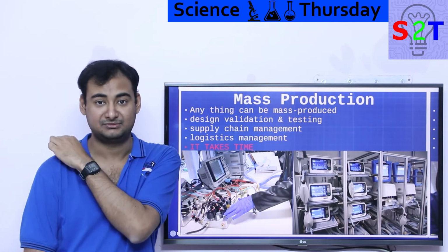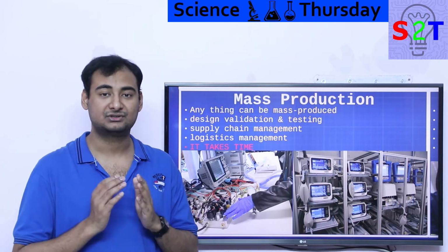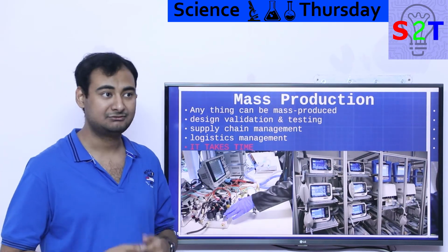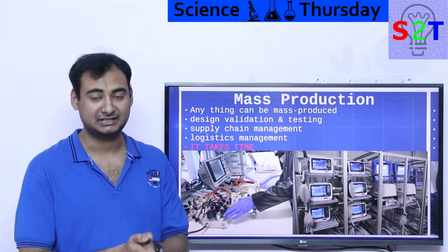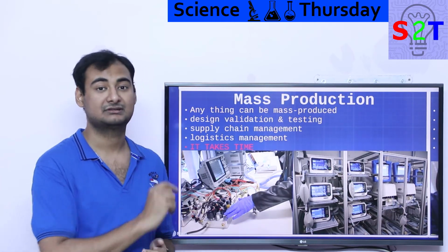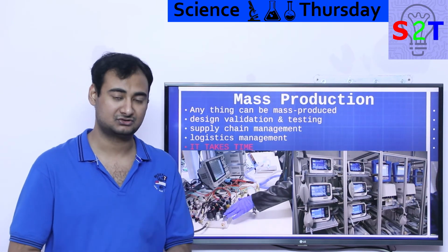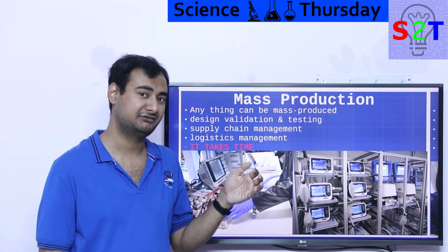Then you have logistics management. You cannot just sell these, you have to track them. Why do you have to track them? Because if there is any flaw in any of the systems, you have to double check it. You have to say, okay, this ventilator stopped working, why is that? You have to analyze it, tear it apart, and see whether everything is okay and this was just a bad unit. What if there was a flaw? Let's say this motor stops working after like 80 hours or something, or a transistor stops working. You have to have the ability to recall all of them, otherwise you are putting other people's lives in danger.